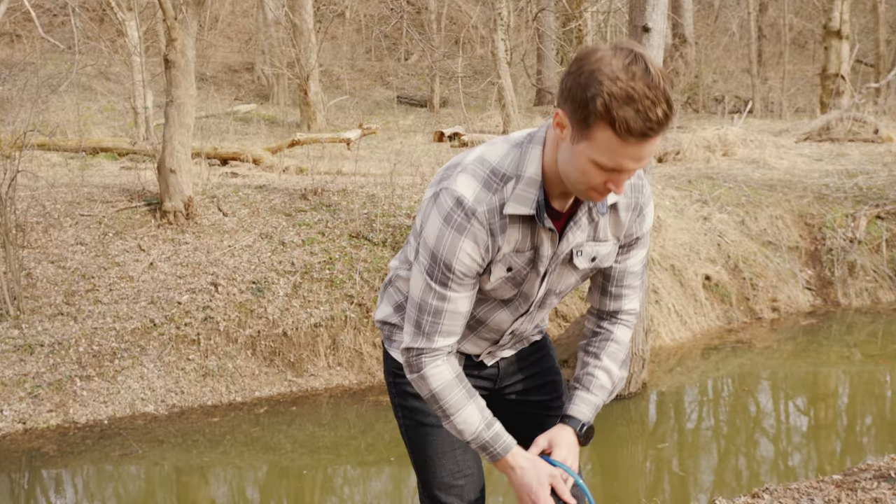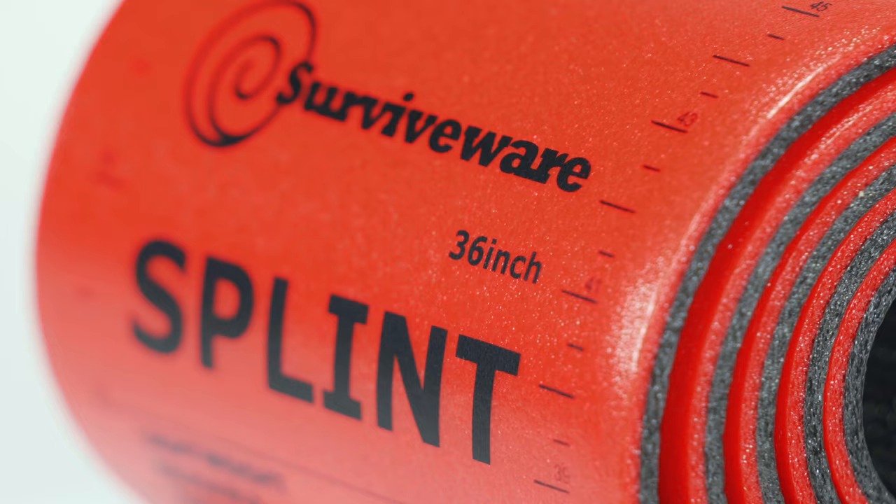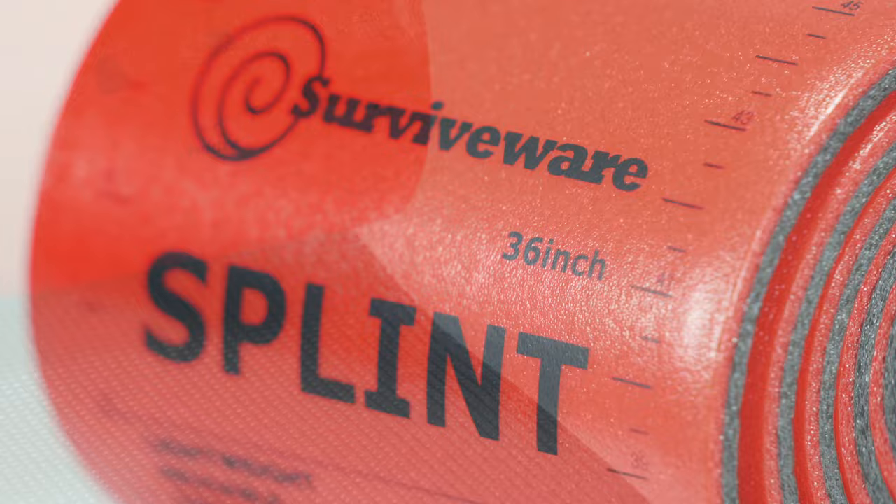When you're on the road, an accident happens in a flash. That's why carrying the right first aid equipment and planning ahead is so important. With the SurviveWare 36-inch waterproof splint, you're covered for sprains and strains.